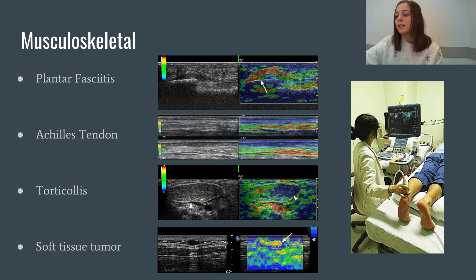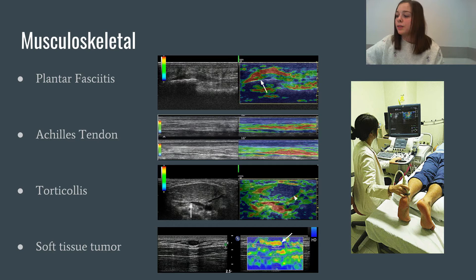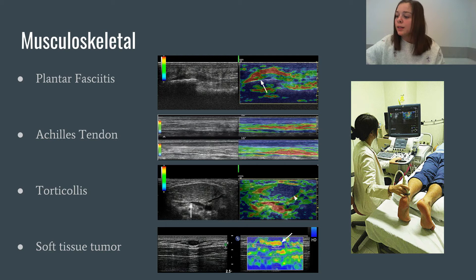The last kind of tumor detected by musculoskeletal elastography is soft tissue. These are malignant tumors and are generally stiffer than benign tumors — they will appear blue on strain elastography. Lipomas can range in color from red to blue. Vascular soft tissue tumors such as hemangiomas were red to green with no blue, and neurogenic tumors were green with no blue. Malignant tumors showed higher strain scores, usually between 3 and 4. The ultrasound and elastography image demonstrate a 33-year-old man with a palpable mass on his right chin. The B-mode image and strain elastography reveal a well-marginated, soft mass in the subcutaneous fat layer, showing a predominantly orange area representing a soft consistency.